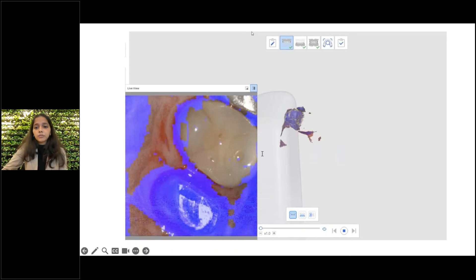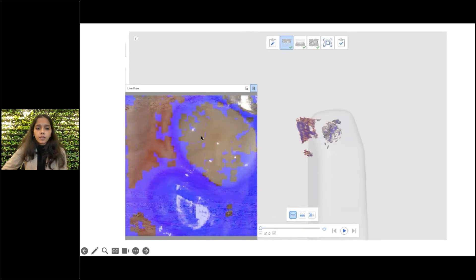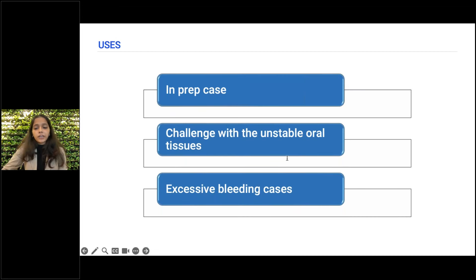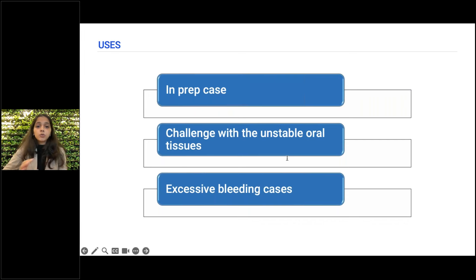So this is the beauty of using the lock area tool. These were some examples from our end, but you can explore the tool and use it in various conditions. The key function is: it locks a selected area of your scan so it remains unchanged during subsequent scanning.